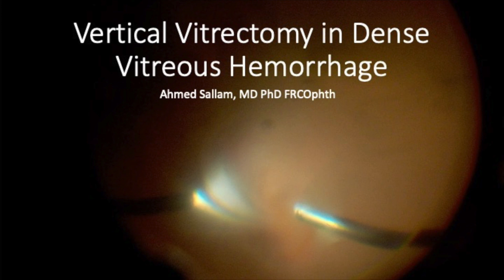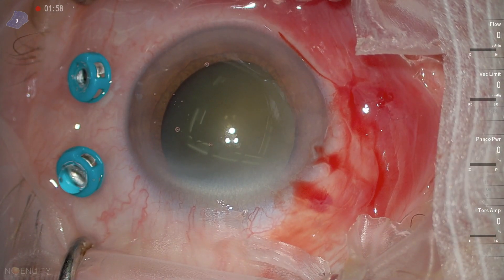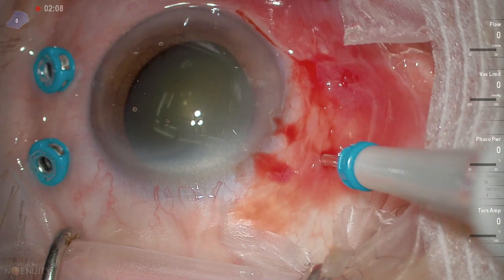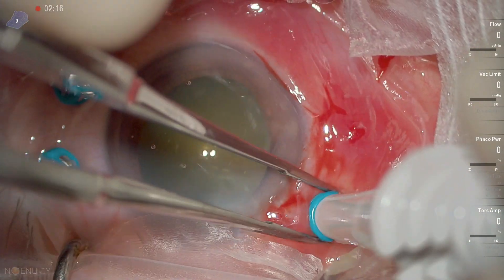This is a case of a dense vitreous hemorrhage in a patient with Eterson syndrome. A resident is starting the case here, putting the trocars. You can see the trocars went very anterior with the first two. Now we're improving on the third trocar. Placing the trocars anteriorly can lead to a lens breach.